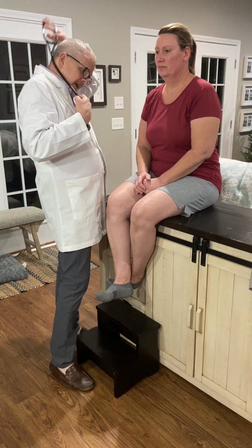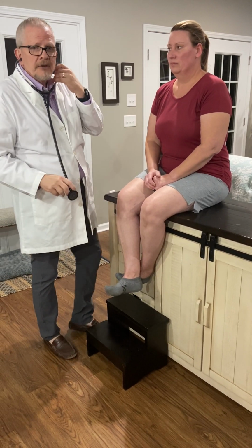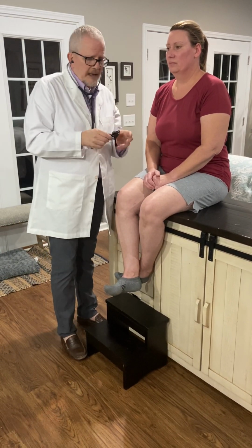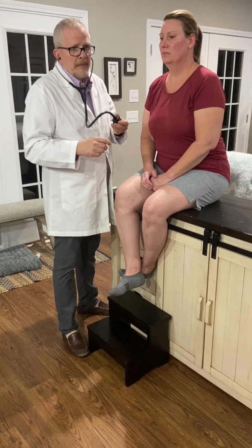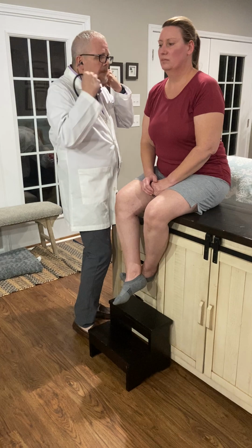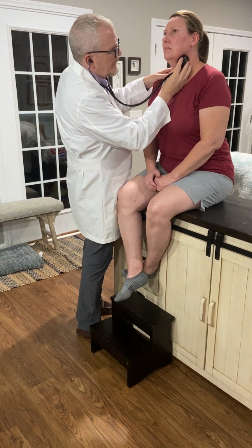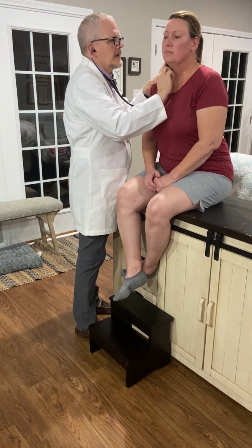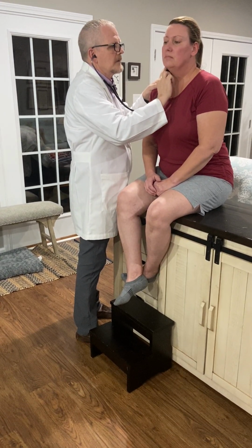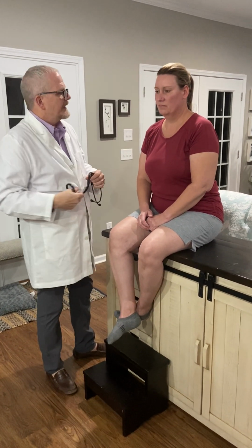The neck, we're going to assess the carotid artery. And normally we would listen to the carotid artery with the bell of the stethoscope. I do not own a bell on my stethoscope. Mine just comes with the diaphragm. It's a Littmann cardiology stethoscope. If you'll take a deep breath for me. Okay. Take a deep breath for me. And hold. Okay. Perfect. No bruits were appreciated.